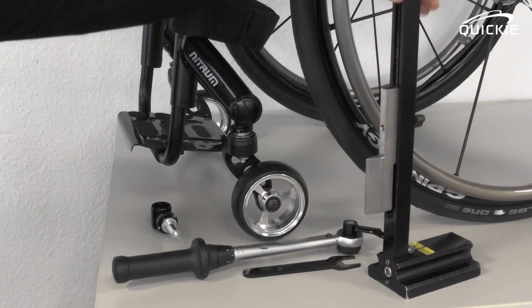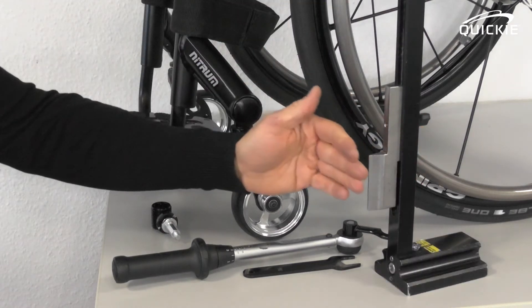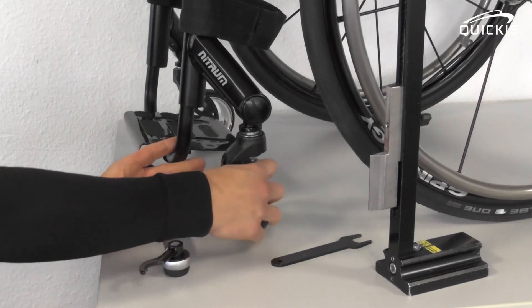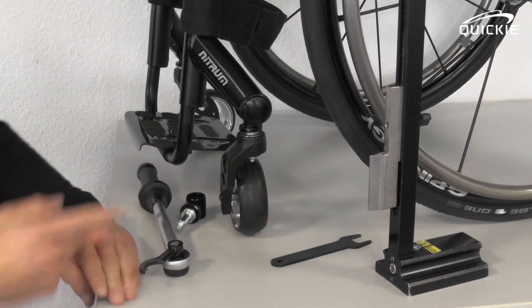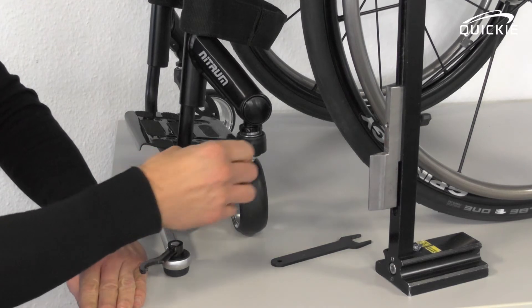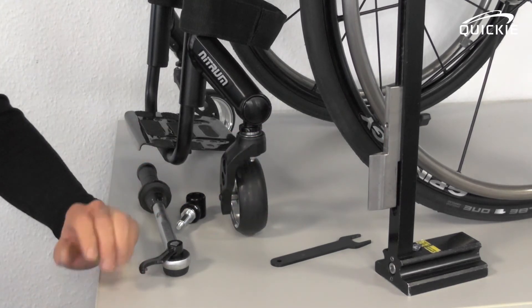We are using a special gauge for that. The only reason for that is that it indicates a 90-degree angle to the floor, which is what you need. Turn the caster wheel so that it's facing inwards and look for the flat spot on the caster fork. On that type of fork it's here. On a dual arm fork, it's in exactly the same position.